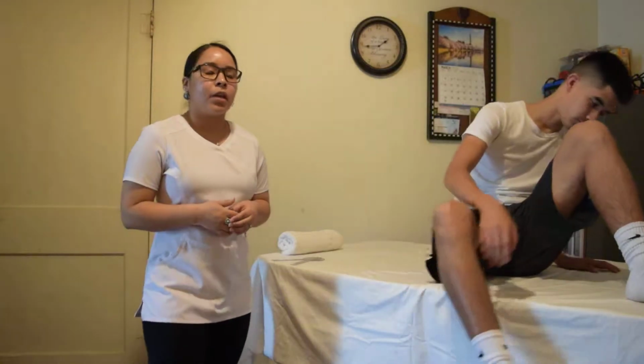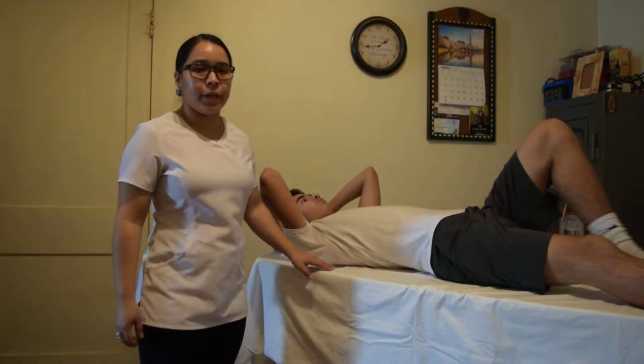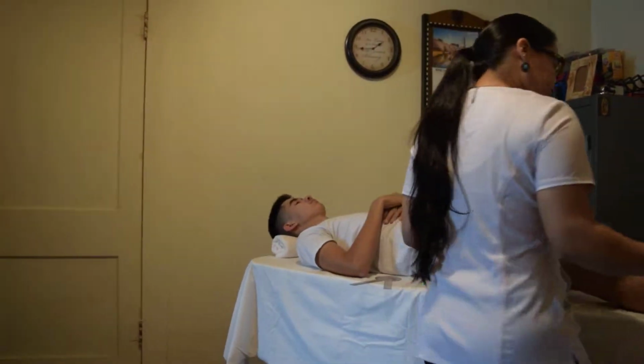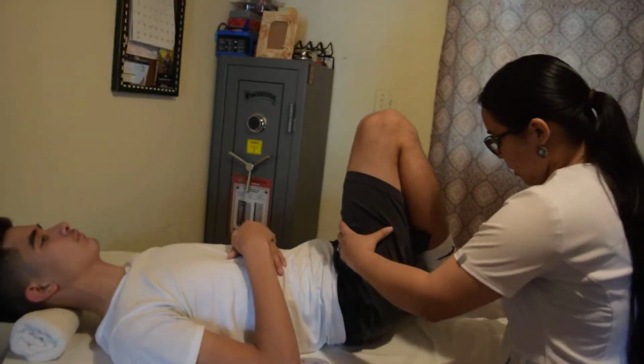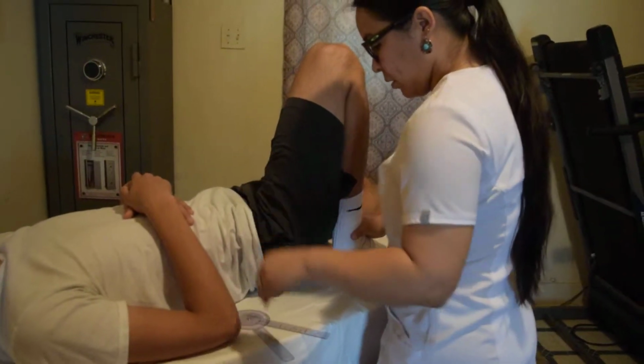I will have Mark lie down in the supine position, which is face up, and I will perform this by passive range of motion to demonstrate. I will start off by measuring knee flexion. So I'm going to go ahead and bring his heel as close as possible to his buttocks.